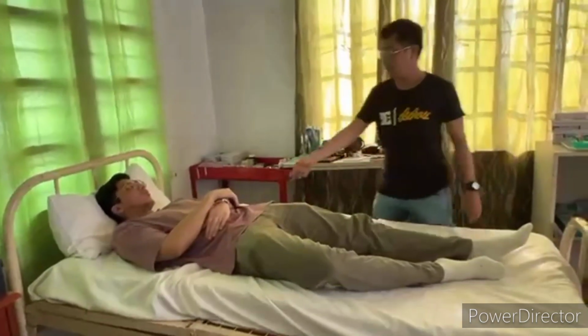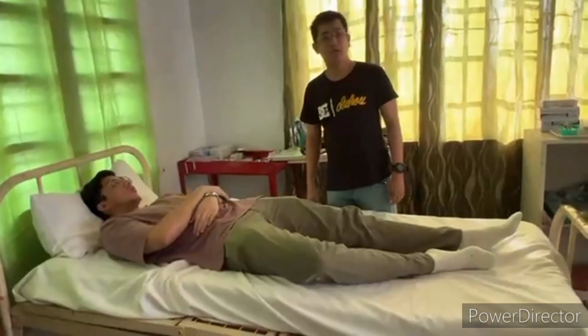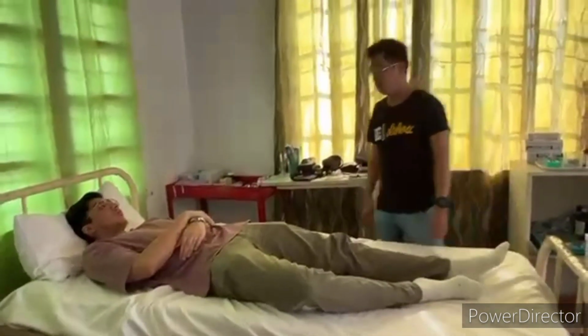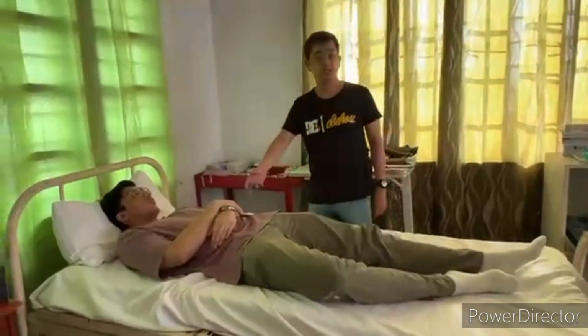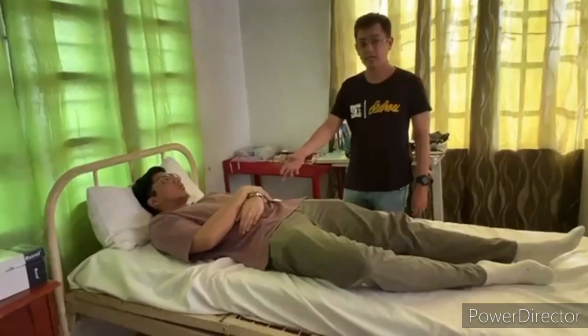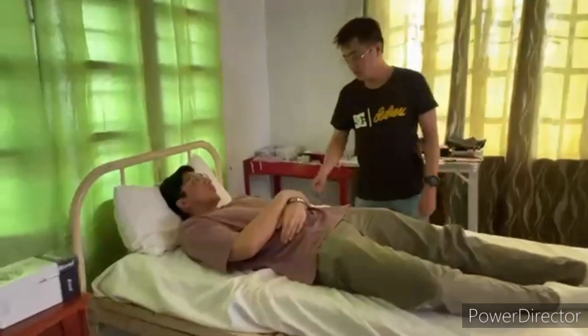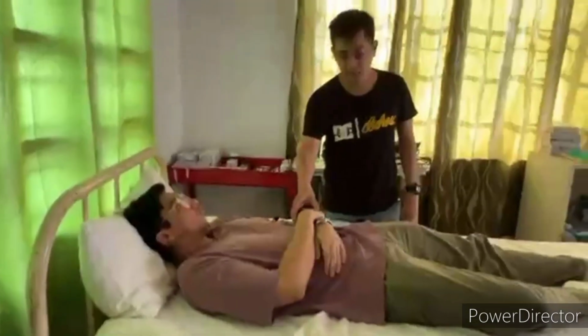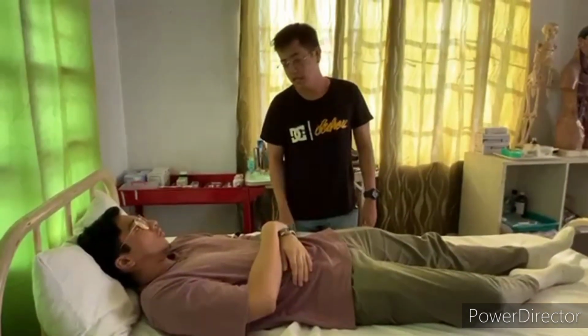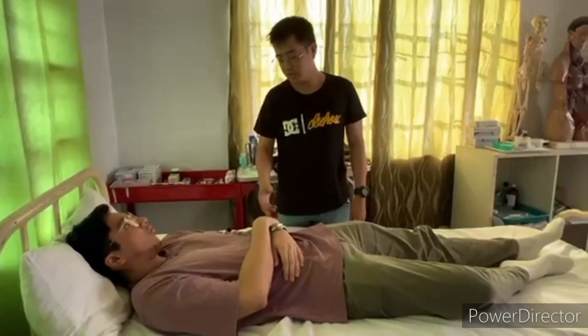Alright, so assuming it's not touching the clothes of the patient. So, and then, while waiting for the beep, we can now get the pulse rate and respiratory rate of the patient. So, in getting both, we have to position first the hand of the patient. But before doing that, we have to ask permission from the patient. Okay? Hey sir, I'm gonna be getting your vital signs now. Can I touch your hand?